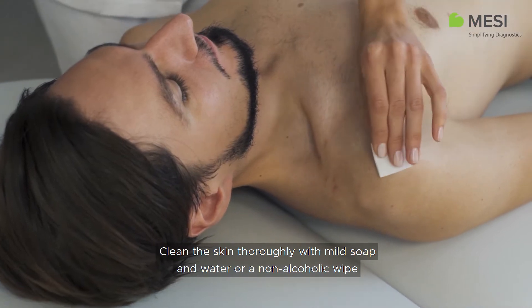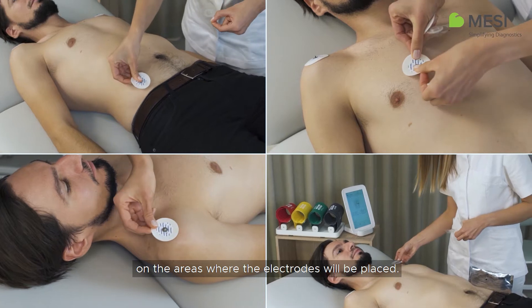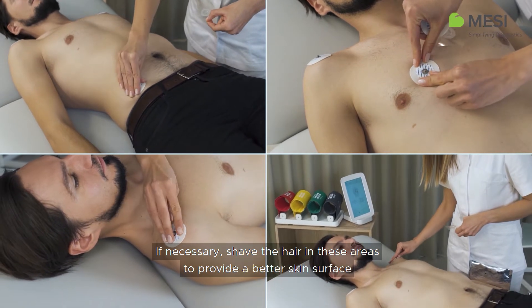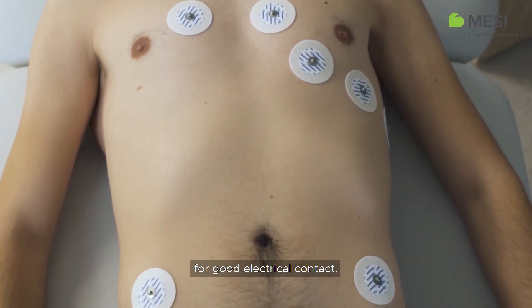Clean the skin thoroughly with mild soap and water or a non-alcoholic wipe on the areas where the electrodes will be placed. If necessary, shave the hair in these areas to provide a better skin surface for good electrical contact.